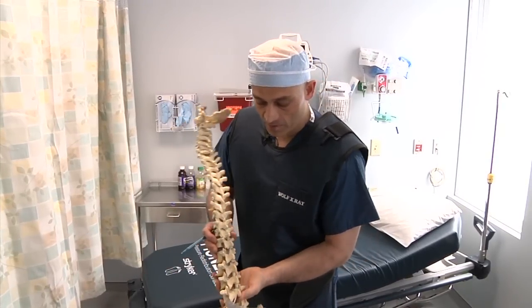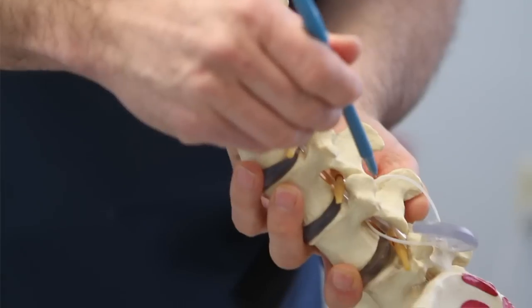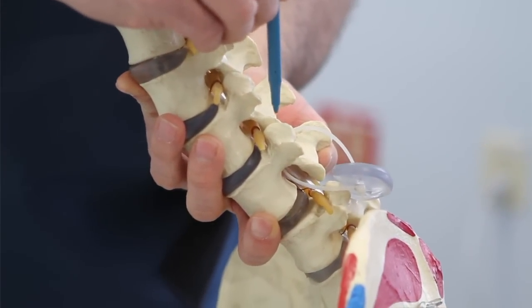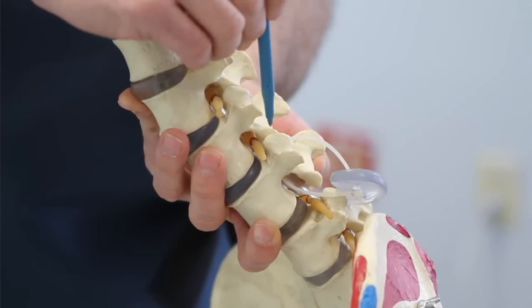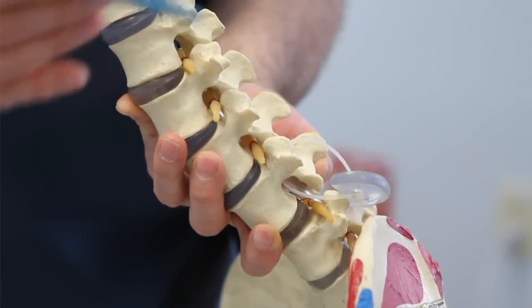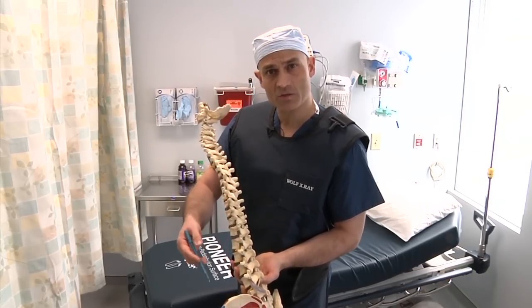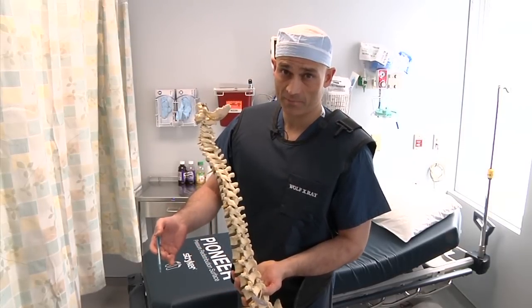Turning the spine around, I'm going to demonstrate the lumbar facet joints. These are the small joints in the back of the spine which provide some stability and motion, but which are prone to degeneration and can lead to the onset of back and sometimes leg pain.